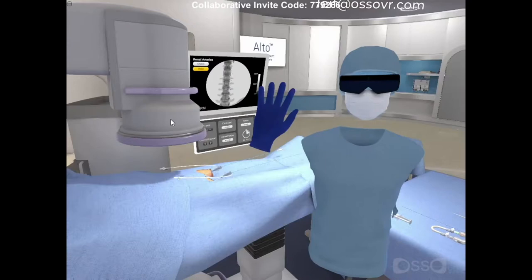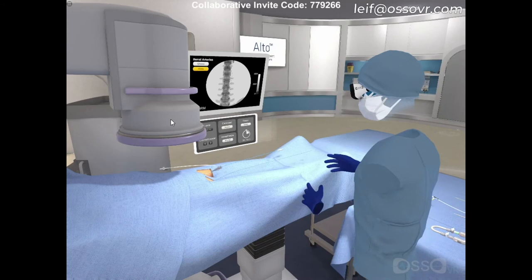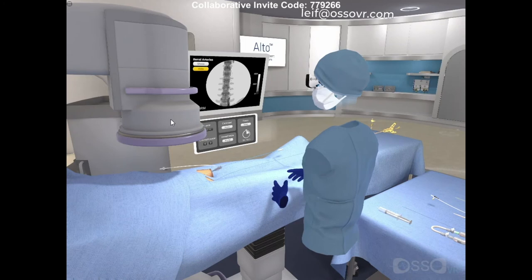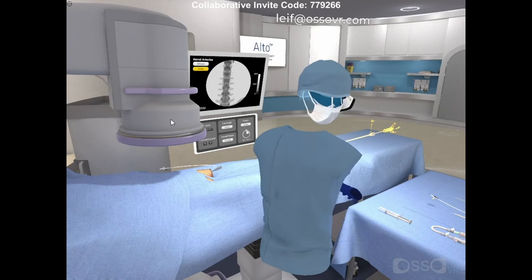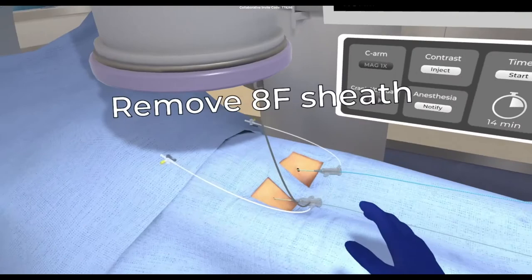This is a device that is designed to be threaded up inside the femoral artery into the aorta to treat an aneurysm. An aneurysm is a big bulge in the aorta. It makes me use the imaging system, inject dye, get the right views and the right angle injecting that dye. And shortly you're going to switch to looking through my eyes. I'm in there wearing one of these Oculus Quest headsets. They're now owned by Facebook. That's the user's view, taking the device out.